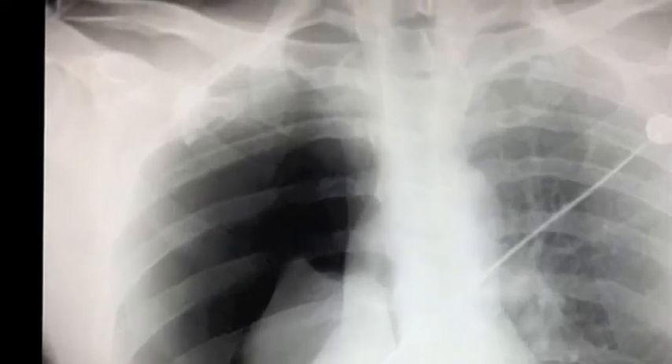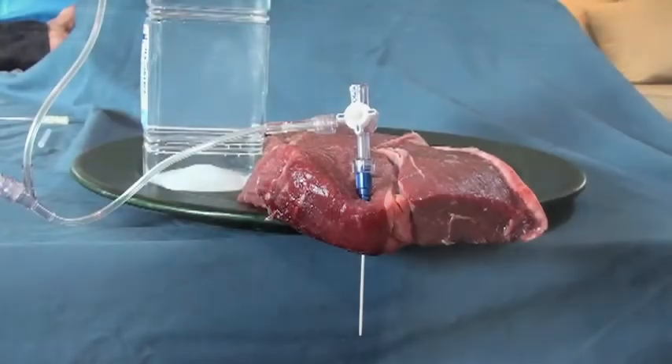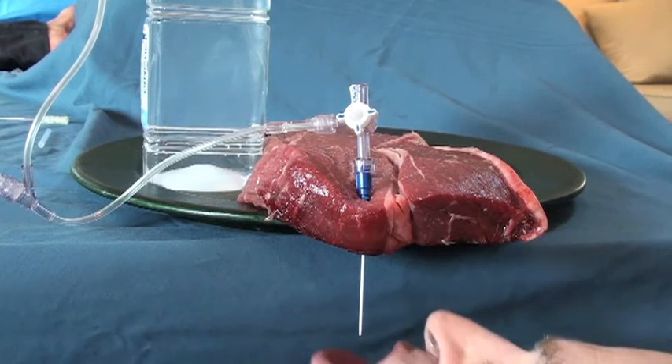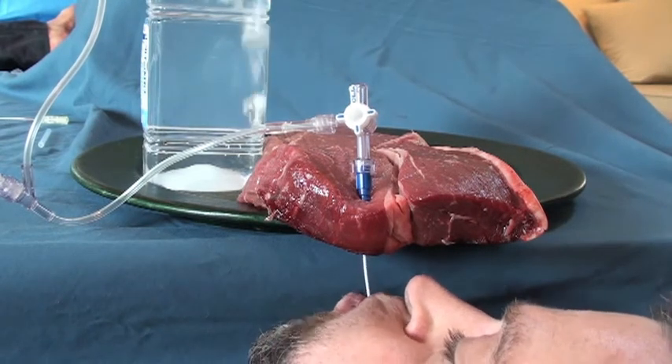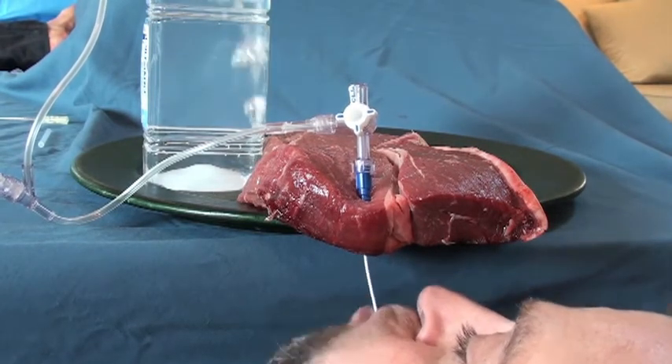The angiocath is way up here, right over the second intercostal space where I placed it. And if you leave the stopcock in the correct position, if pressure builds up again inside the chest cavity, that pressure just comes right out through the water seal.